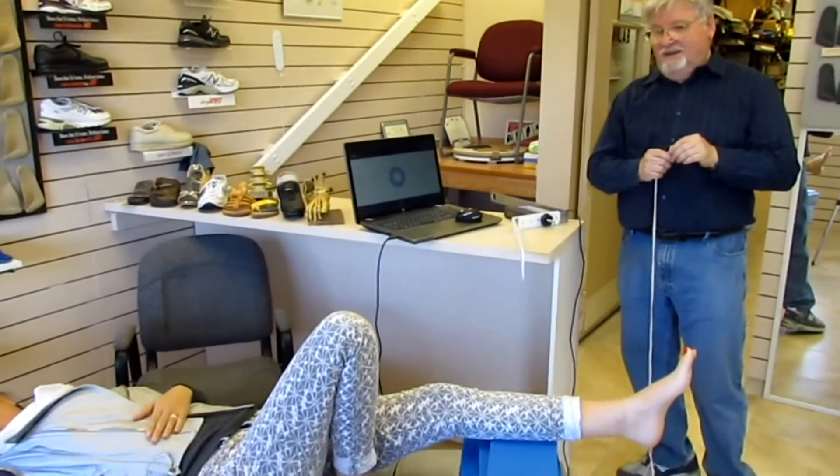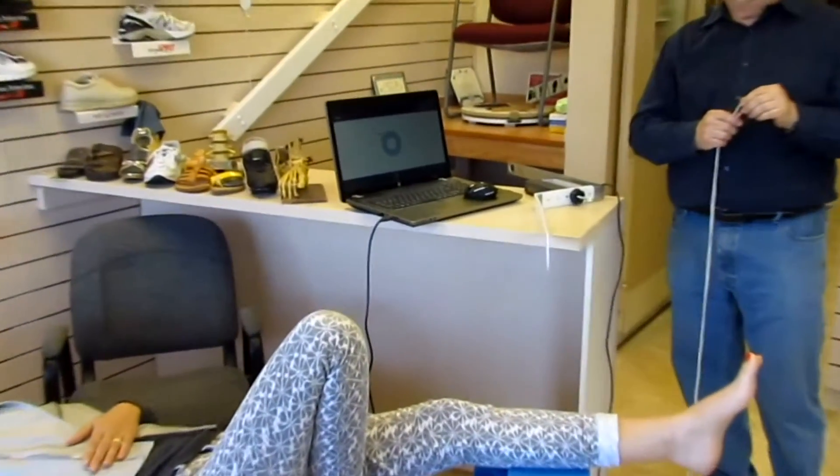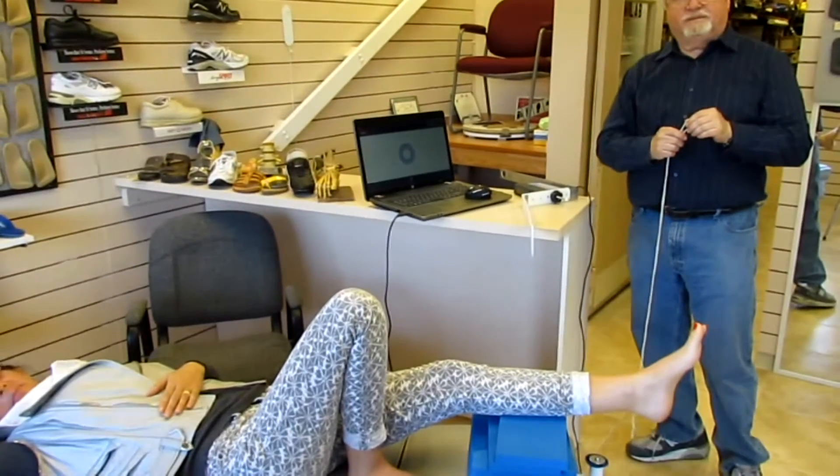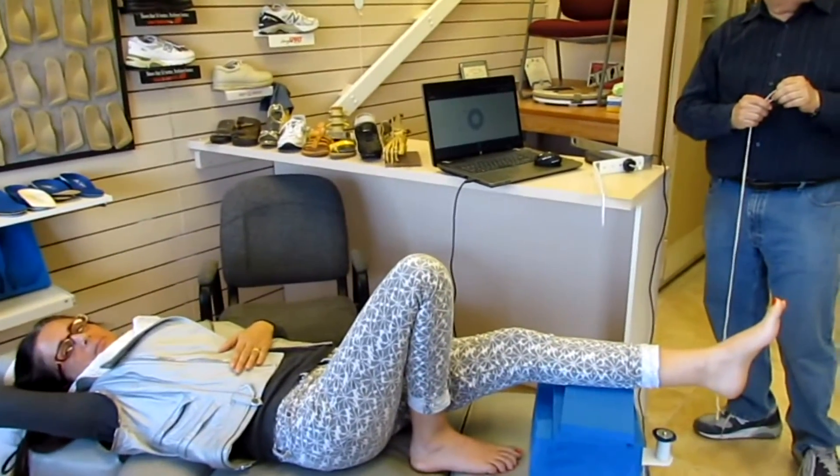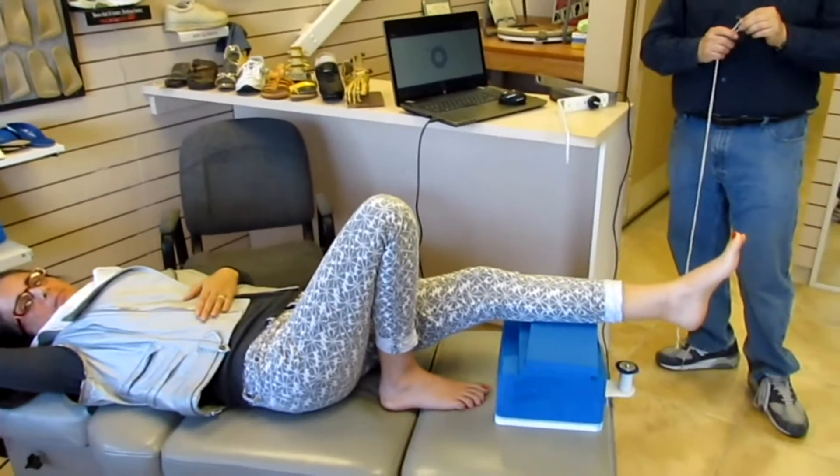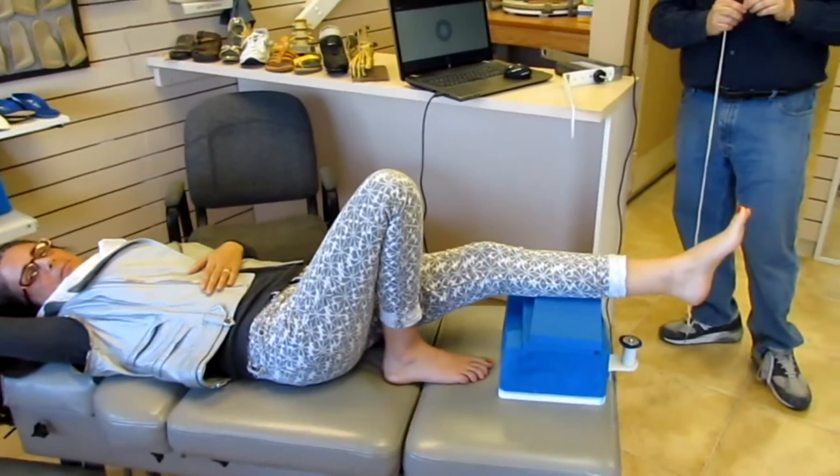Okay, here we are back at Foot Function Lab, and we're going to demonstrate the foot 3D scanning device and how to do the entire procedure.